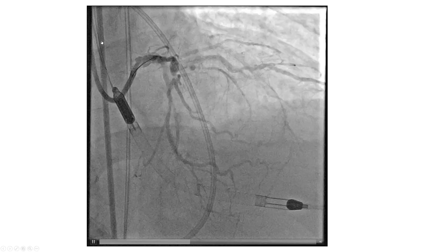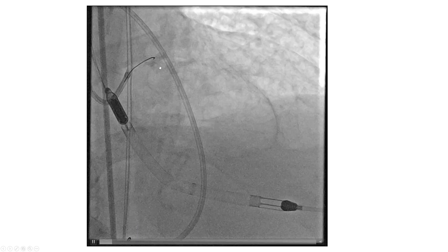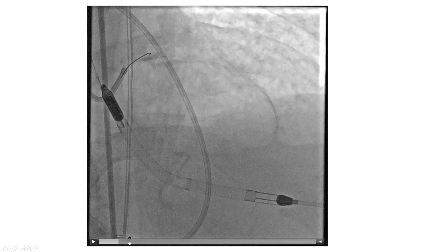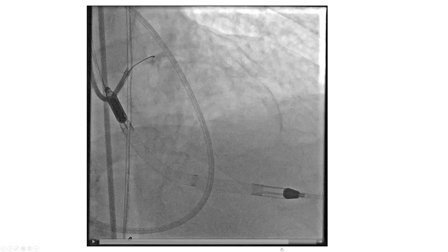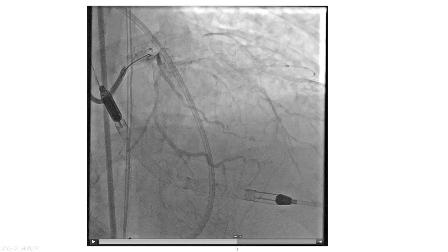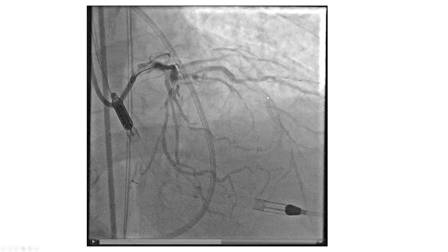This is one image from the coronary arteries — a lot of overlapping making it hard to interpret — but the patient does have an occluded LAD immediately after the takeoff of a diagonal branch. There is a large diagonal branch, and then there is a CTO of the LAD with diffusely diseased distal vessel.